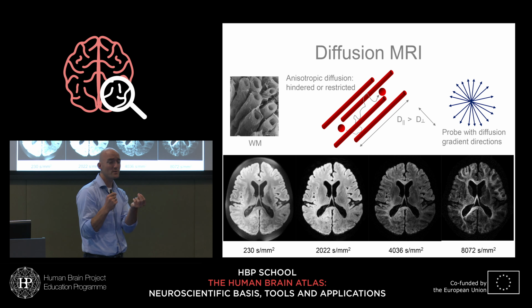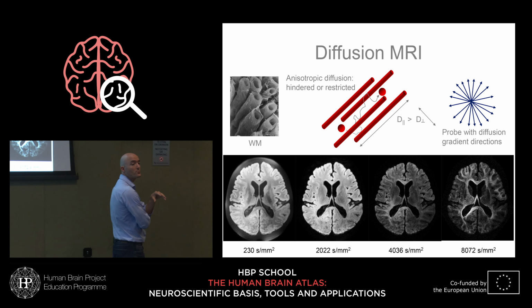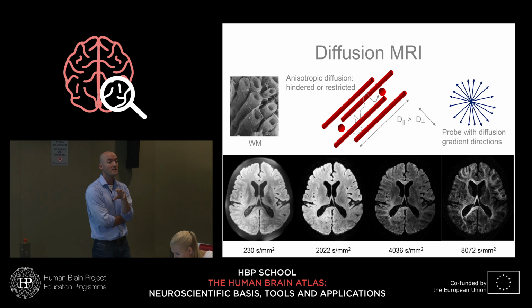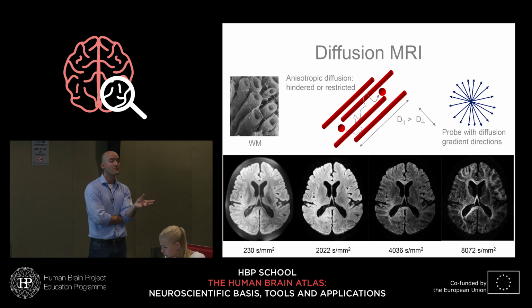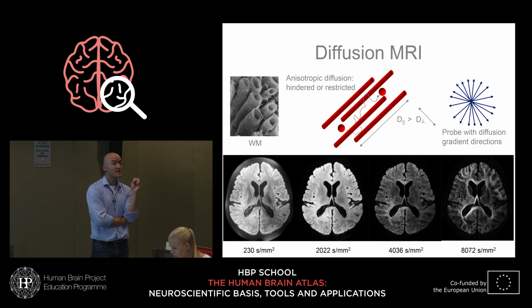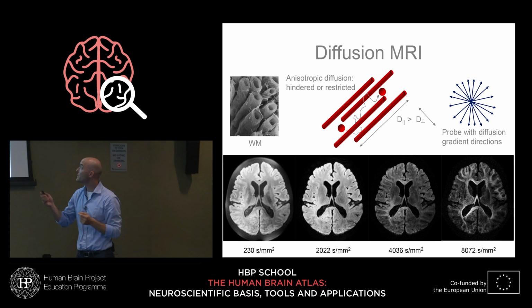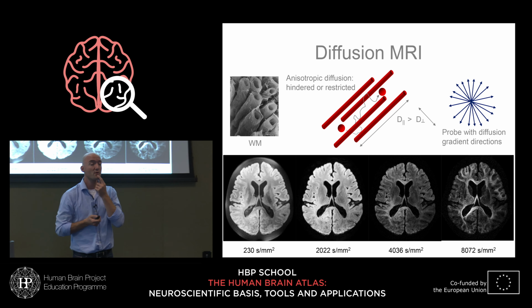You can see the struggle that we have with fixation in diffusion. What we generally do when we work with slightly smaller samples than a whole human brain is fix them. We have to, because we want to scan them for a very long time, and they will not stay fresh for very long. But once they're well fixed, we will generally soak them in PBS with some azide, to keep the fungus out, for weeks to make sure they get rehydrated. That gets our diffusion back from a quarter of the in vivo value to half of the in vivo value. Otherwise we get 100% more signal again.